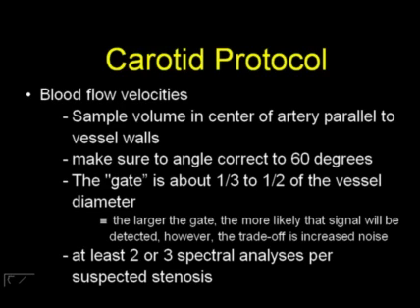It's almost always possible to obtain 60 degrees. Of course, you never want to use more than 60 degrees. In any case where you're using less than a 60-degree angle, I believe that it's appropriate to document which angle you're using. And again, this is particularly important in follow-up studies. If you're using anything less than 60, when you're doing a follow-up for comparison, you really want to make sure to use the same angle during that follow-up study.